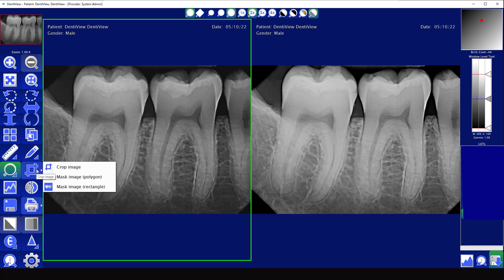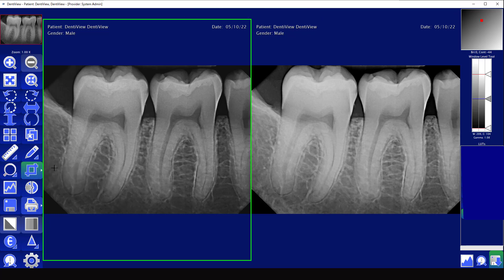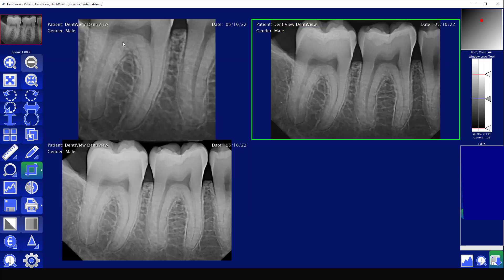The cropping button is not commonly used, but it allows you to crop out a section of the image and store it as its own image. If you wanted to crop out a specific area, you would highlight that area and it will save as its own individual image.